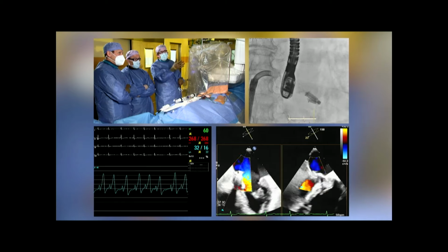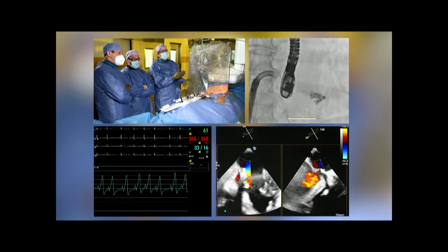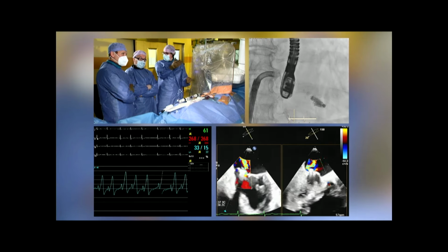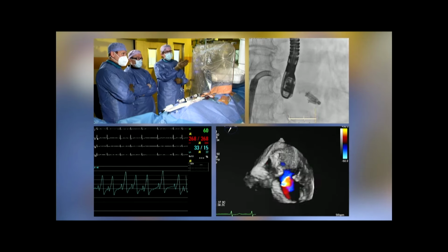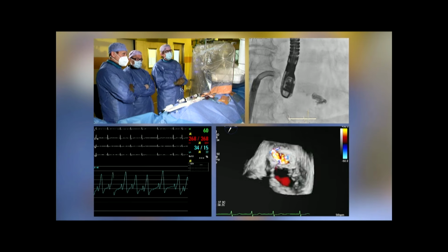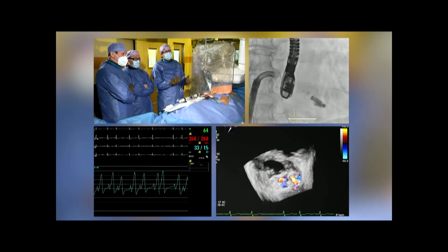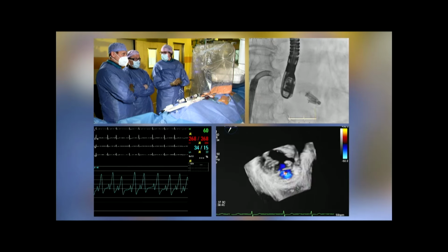Yeah. You said the device looks very stable. I agree. For the pathology we treated, if you see something like that in functional, then you're slightly worried. But in degenerative, that's to be expected, and it sort of supports our decision to go for a second one, right?